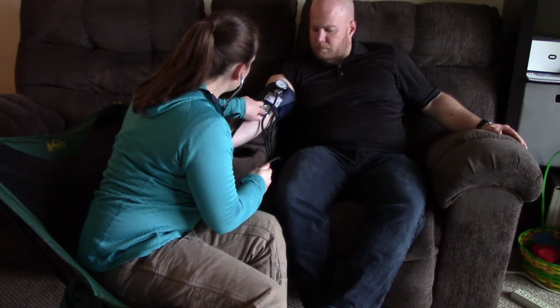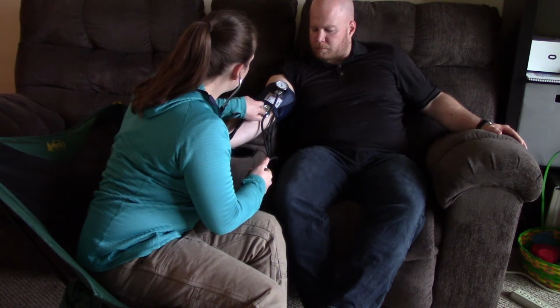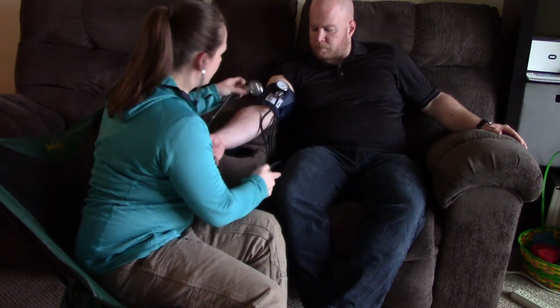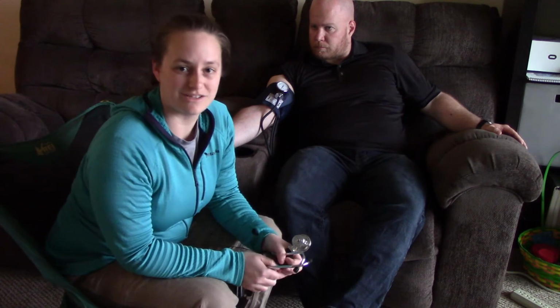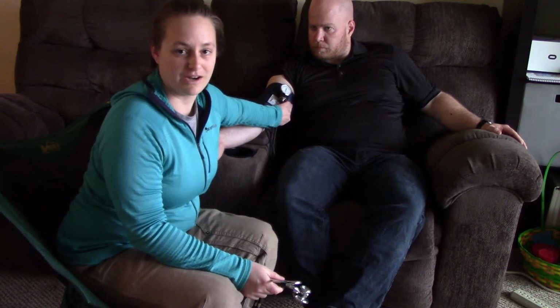Okay, now I'll slowly let the air out, and I'm listening for a heartbeat. Still don't hear anything. Okay, I just heard the first heartbeat, and I'm still listening, still beating. Okay. So I heard the first heartbeat at about 138 and the last heartbeat at 98. So his blood pressure is measuring 138 over 98.